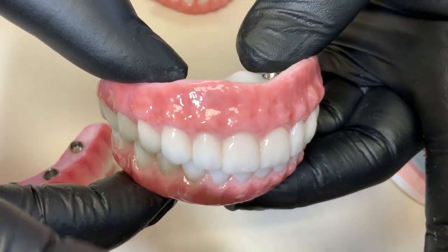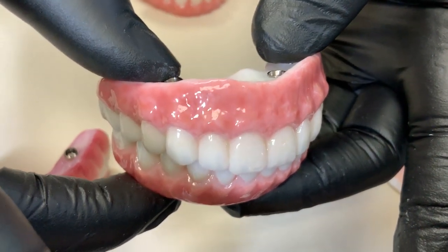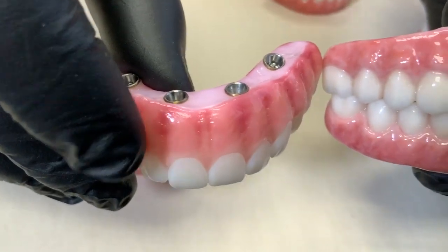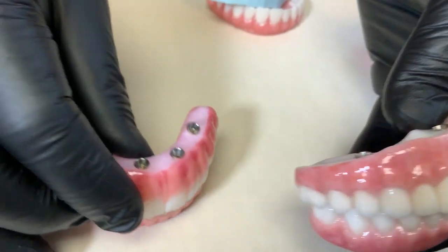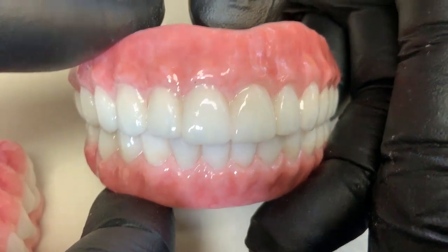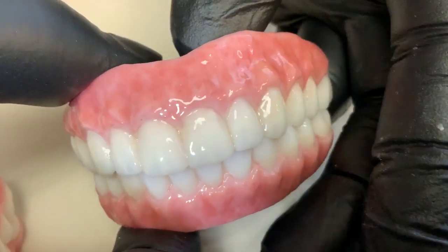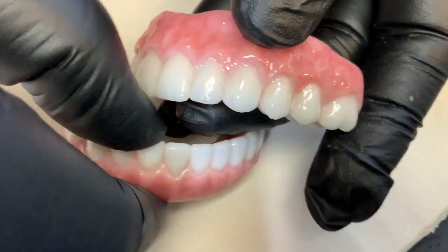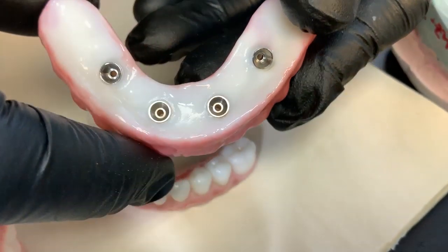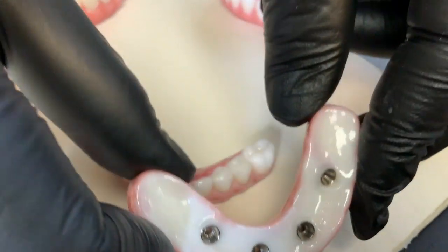Number one is patient doesn't like the gum color — it looks like disease. We changed the gum, and I noticed this one is over-glazed. This is really dehydrated, and I see some kind of stain here. It's more of a hygiene problem. You cannot make it like that, otherwise the patient can get a lot of food traps.